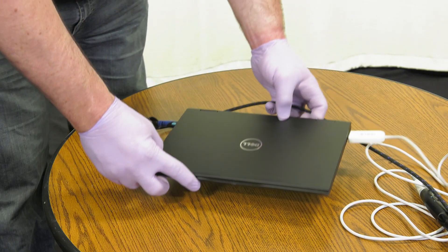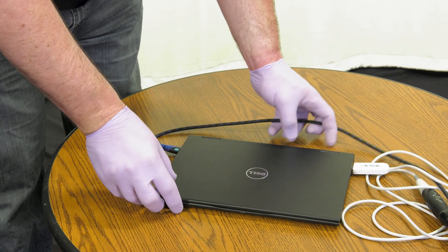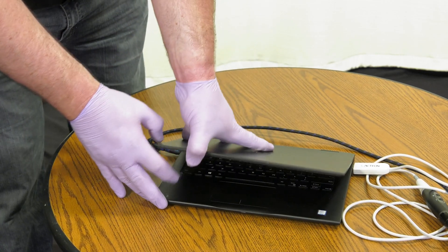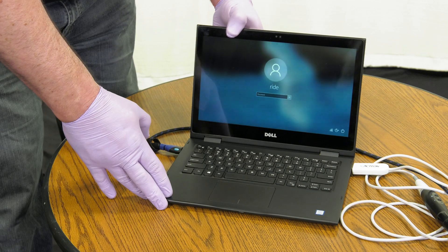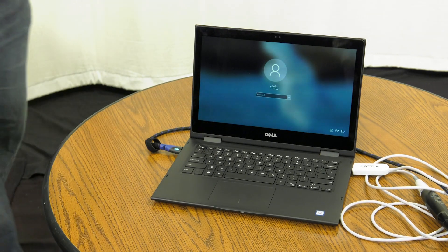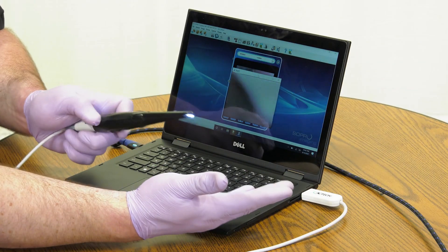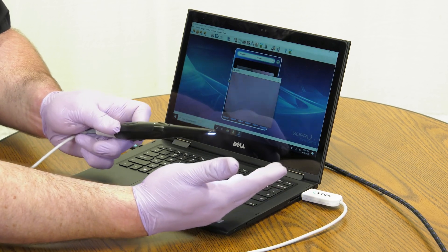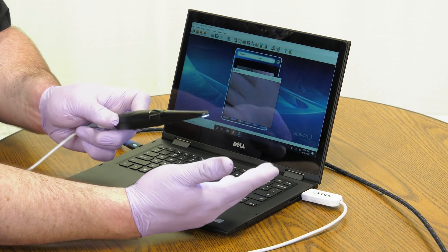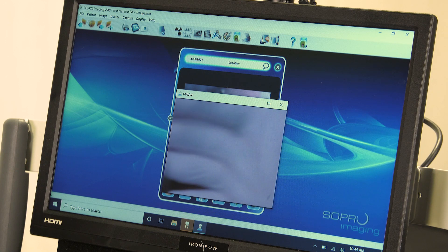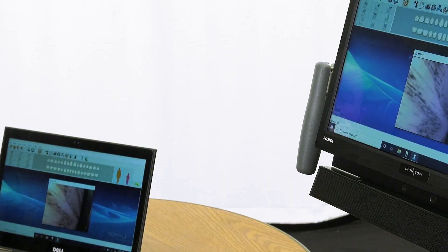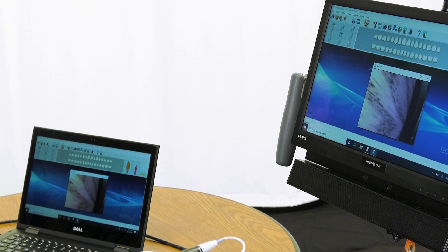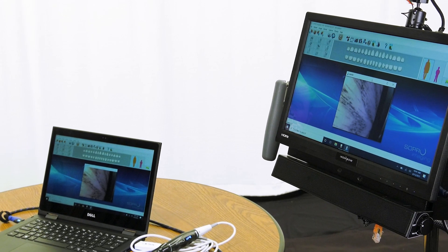It is recommended to have the laptop placed on a flat surface while connected to the cart to ensure it does not fall over in case the cable is tugged. When connected to the cart, content from the laptop, including images from the diagnostic intraoral camera, can be displayed on the cart's screen during a video call. All three components are utilized together to provide the full functionality and purpose of the cart.